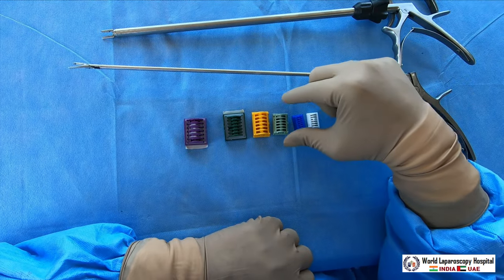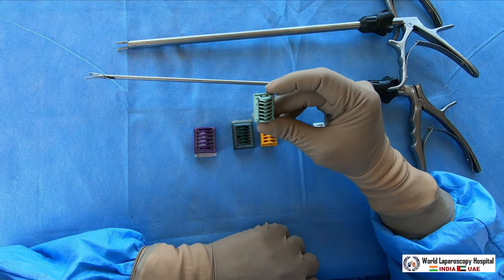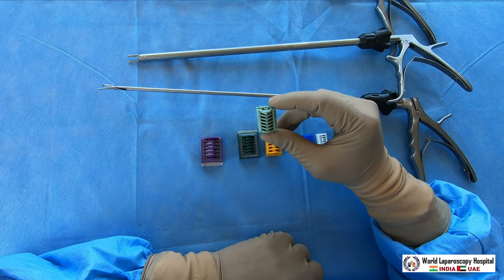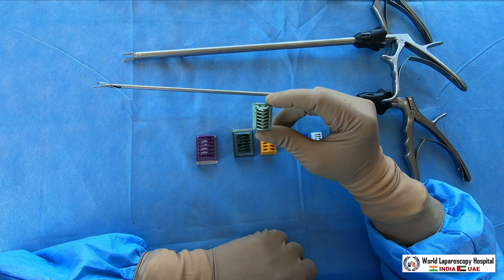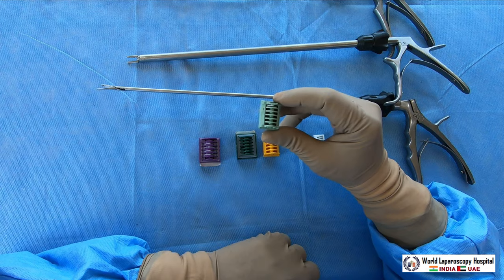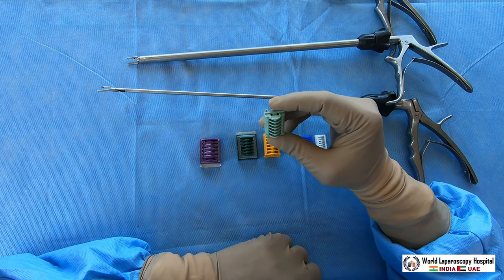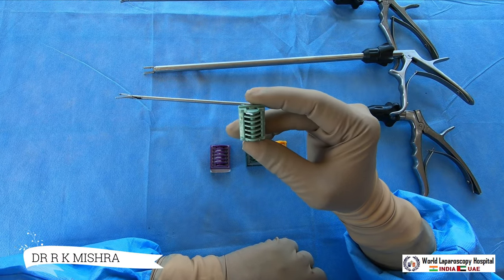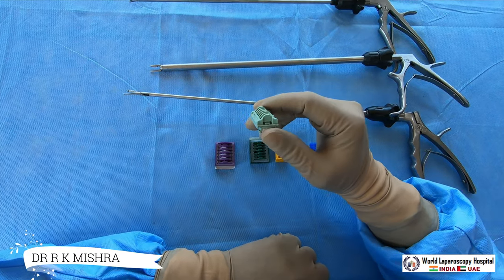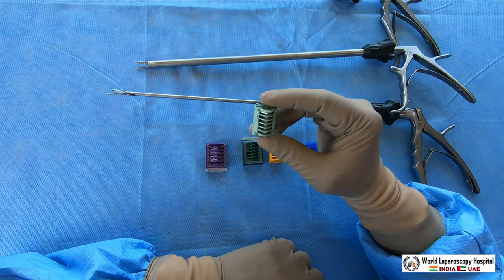Whenever we do cholecystectomy, the most commonly used is the green cartridge. Green can be used safely up to 6 mm of blood vessels — for the cystic artery or appendicular artery you can use the green cartridge. This is called the medium-large size. Different companies give different coding like LT300, LT200, LT400, but basically green is used up to 6 mm of the structure.